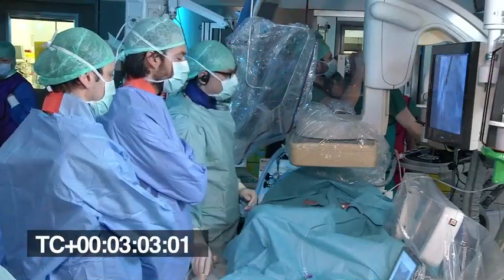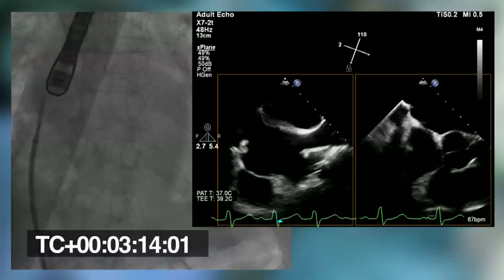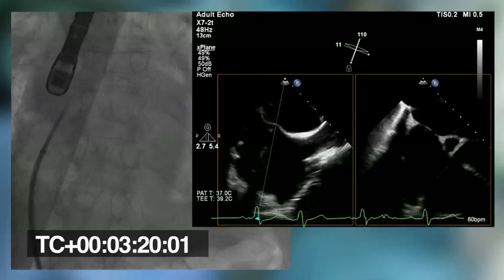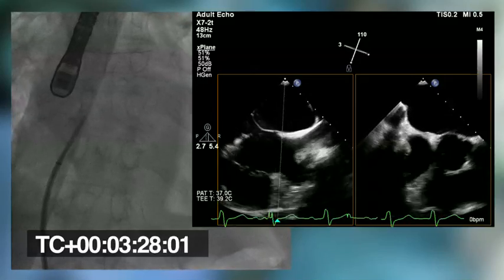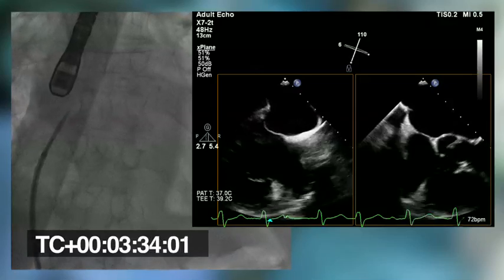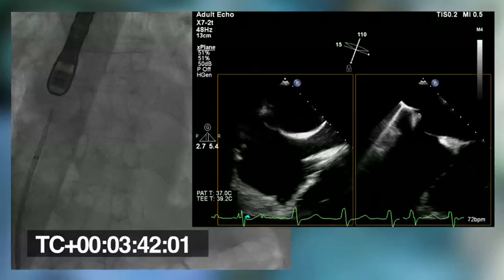This is the bicaval view, which we need to start as with any mitral intervention. I get tenting already in the superior vena cava now. I'm now in the superior limb, getting now into the fossa. I want to be a bit more anterior — pull back. I don't have tremendous contact. This is a bit better but very posterior now. I'm not happy, so I will go up again and try a different location.